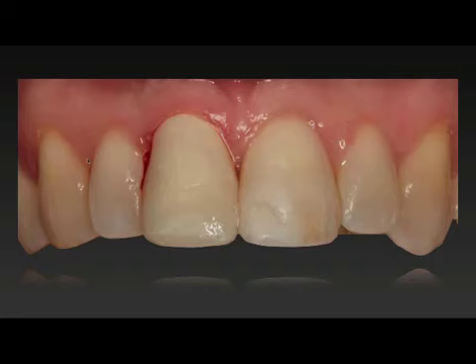Now, if we take this similar case, and this was perhaps a little mismanaged in terms of treatment planning, but something very similar, if it would have happened with titanium, there is no recourse from something like this. We would have had probably dark lines in the tissue. We would have had much more tissue recession once we connected the abutment. This would have been very unfavorable. With this ceramic, we had a little bit of help from higher powers in terms of our final results. This is the final radiographs. This is again before definitive restoration.